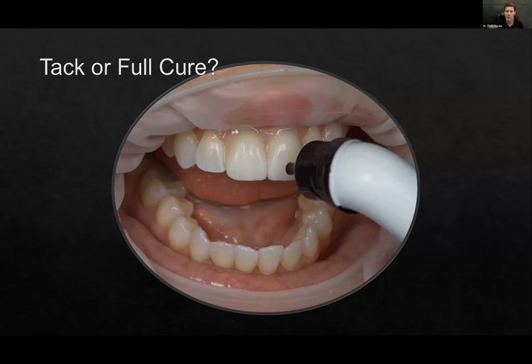I don't want to wipe on the margins because I'm afraid potentially I'll pull a little bit out of a margin that I can't see. And by having pulled that out of a margin, now you have the risk of leakage or a brown line later on, which I don't want because you can't go back and seal that up. Okay. Now you may say, well, hey, what about the interproximal contact? If you're not cleaning off all your margins, if you're not flossing, you're going to have to go back and clean that out. Yes, you do. And it's a little more challenging, right?